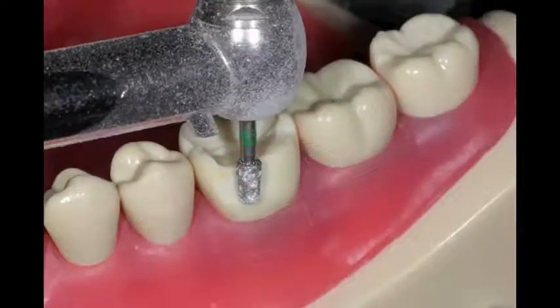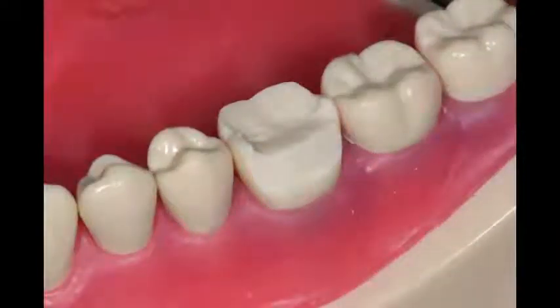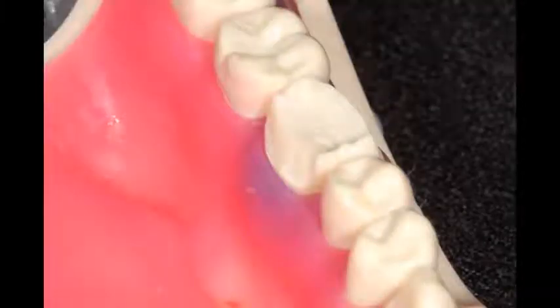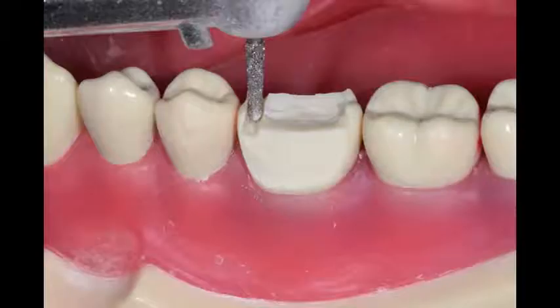After that, I'll move on and prep the buccal — not all the way down to the margin, just making sure that I'm getting enough bulk of the enamel removed. Then I'll prep the lingual, and then I'll prep the interproximal. When I prep the interproximal, I'll switch over and use the regular shaped diamond burr.